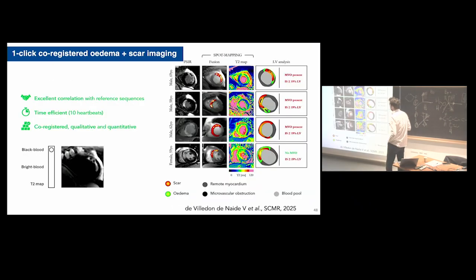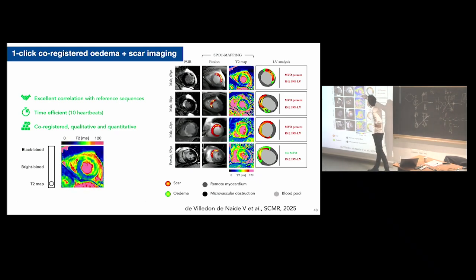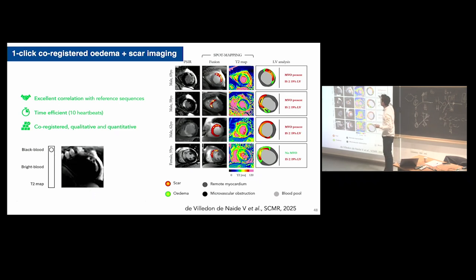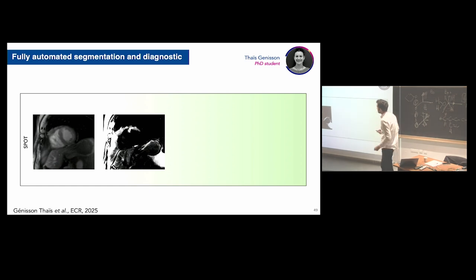These are results. I'm going to skip that. Maybe look at these patients here, for example this patient with myocardial infarction, the one we saw before: a big inflammation way above the threshold that was proposed in the article, a size of the scar way above the 19% of the ventricle, combined with LVEF below 35%. We know that this patient would really benefit from the implantation of the ICD. And we could do it fully automatically, actually.